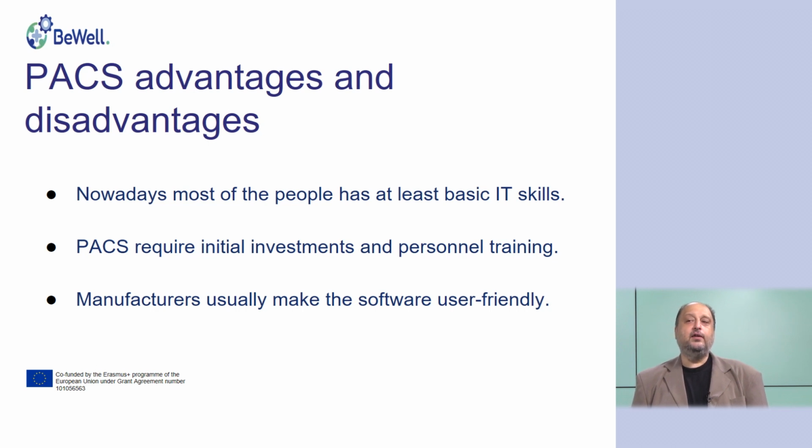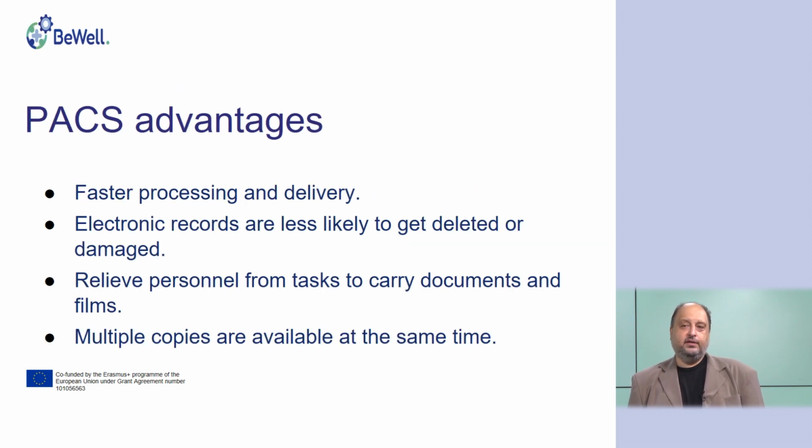They require only very basic IT skills. PACS require some initial investment, of course, and personal training. But because manufacturers make this software very easy to use, usually the staff training is not intended to learn IT skills, but to explore the full capability of the systems. So what are the advantages?